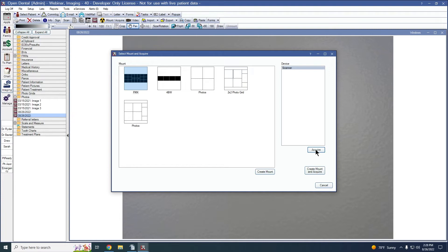To acquire a series of images, select the desired mount and device and click Create Mount and Acquire. The mount will be added to the default imaging category set up on the mount definition and images will be added to the mount. If no default category was set, the mount will go into the selected imaging category. And if no imaging category is selected, it will go into the top imaging category.